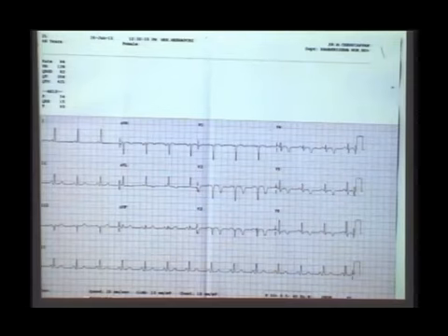For example, why is this all important? After 7 days, if the ST has not settled down. You expect the ST to settle down by 7 days or 10 days, and then you discharge the patient. For example, you continue to have ST elevation. The patient has continued to have a coving ST segment elevation even at 7 days, 8 days. The ST is not settling down.